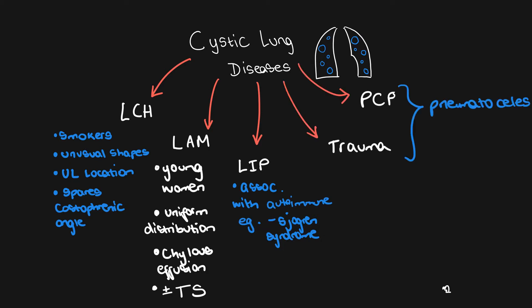The other thing to remember when you see cysts in the lungs is to make sure that it's not a pneumatocele. You can get traumatic pneumatoceles, and you can also get pneumatoceles in PCP. In PCP, you'll see perihilar ground glass change and reticular nodular opacification, and you'll see the pneumatoceles in the upper lobes.